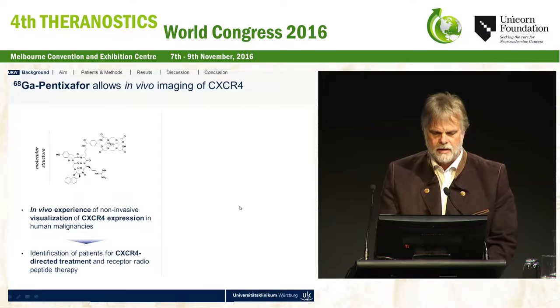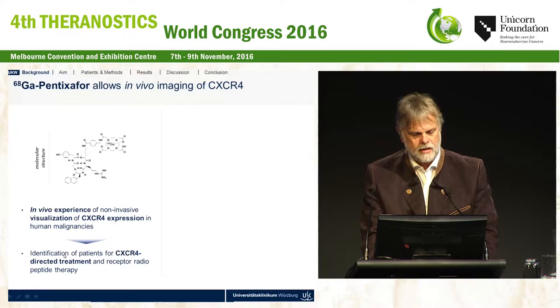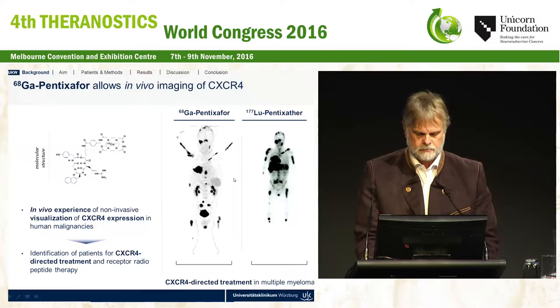And in our department, we have some experience with gallium 68 pentixafor for in vivo imaging of CXCR4. It has been used in a lot of human malignancies, and it is expressed in those entities. What we wanted to do is identify patients that could be used for CXCR4-directed treatment and receptor radiopeptide therapy in conjunction. We did some treatments already in the case of multiple myeloma, both with yttrium and lutetium.